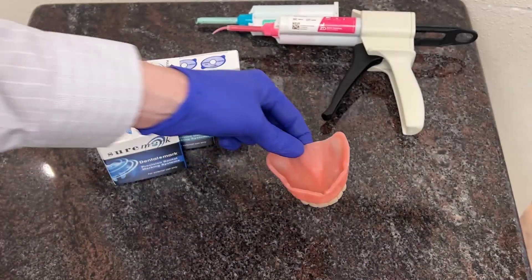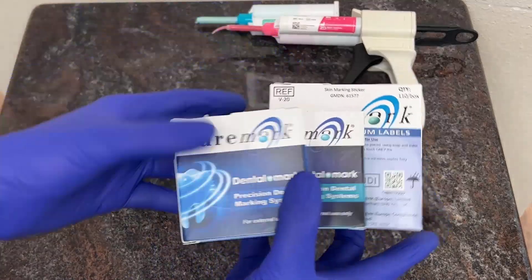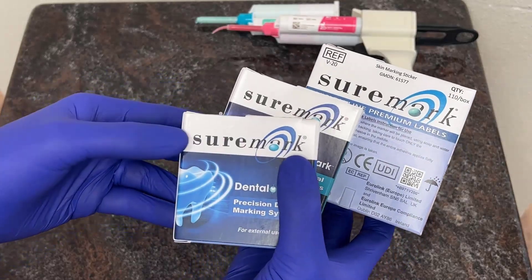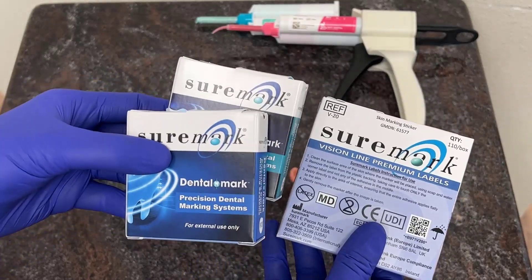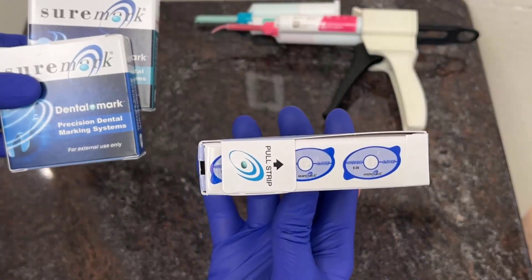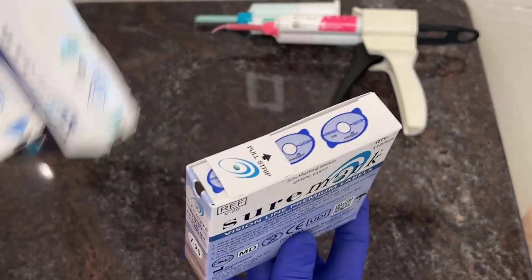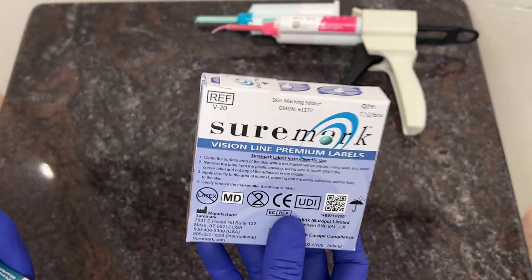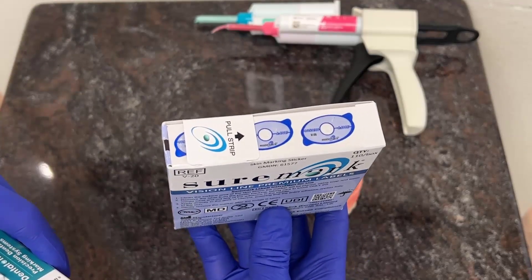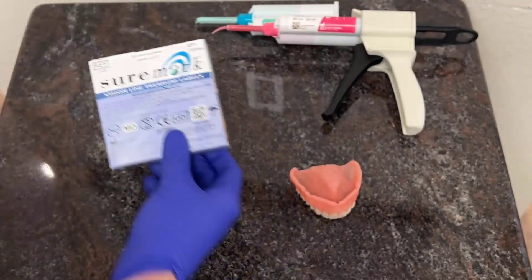When we're ready to prepare the prosthesis, we do need to place radiographic markers on it. Typically, the radiographic markers are going to be something like those from the Suremark company. There are a few different types you can utilize for this procedure. The classic Suremark has an oval-like feel and these are 2mm spheres on a sticker. These work pretty well, but they are a little large for most denture prostheses, so I don't recommend the larger stickers.